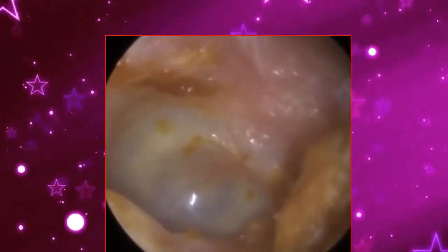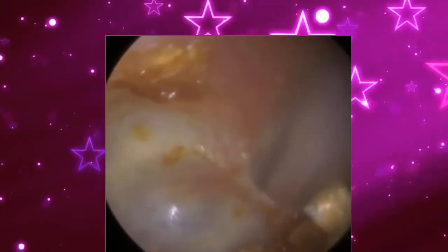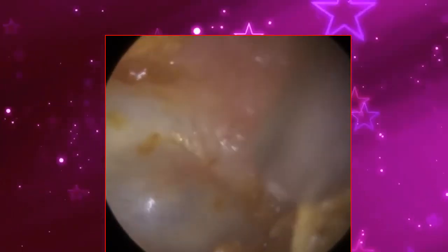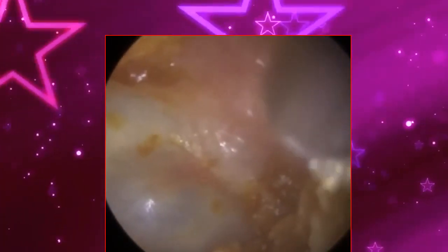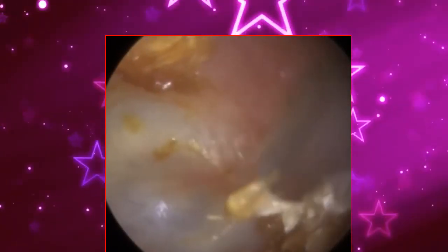So there's the eardrum. It is visible. There is a light reflex. You can see the reflection of the light coming off the eardrum, kind of near the centre to the bottom slightly. That's always a good indicator of a healthy eardrum. Not always. Eardrum slightly opaque, slightly white. So this was an elderly patient. They generally have more opaque eardrums. They're exposed to more acoustic vibrations over the years, so they do get a bit of scar tissue developing.